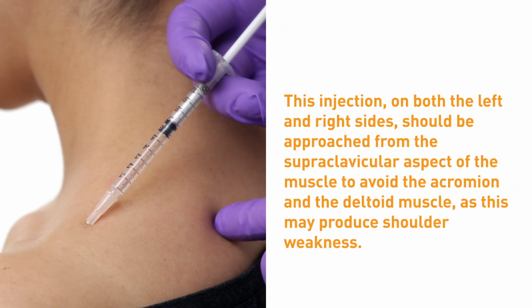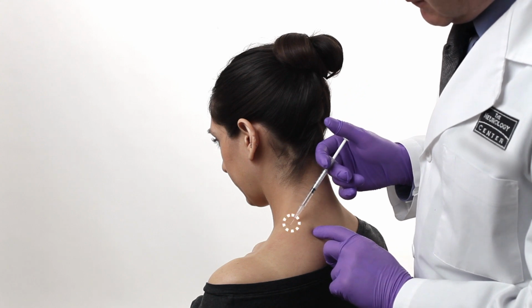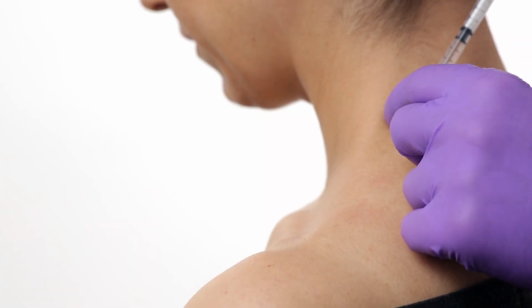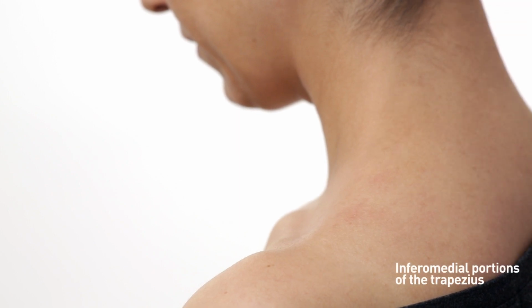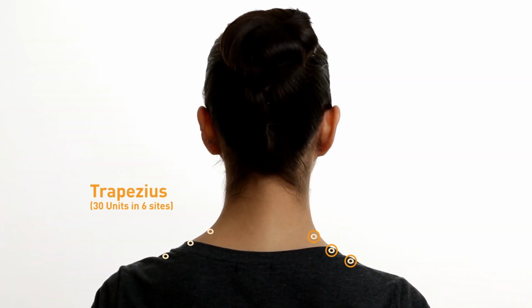This injection, on both the left and right sides, should be approached from the supraclavicular aspect of the muscle to avoid the acromion and the deltoid muscle, as this may produce shoulder weakness. For the third injection, move about 3 centimeters, or approximately 2 fingers breadth, medially up along the trapezius from the midpoint. Stabilize the hub of the needle and make the injection. The inferomedial portions of the trapezius should be avoided to limit the possibility of neck weakness. Repeat the procedure symmetrically for the contralateral side.